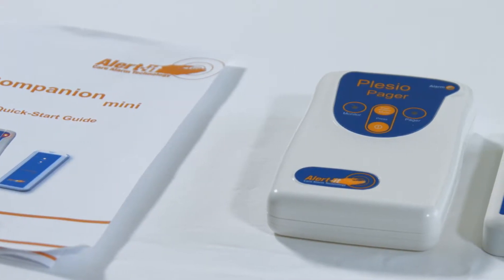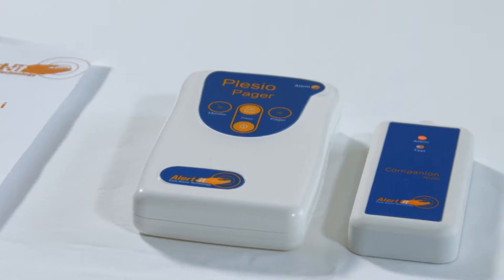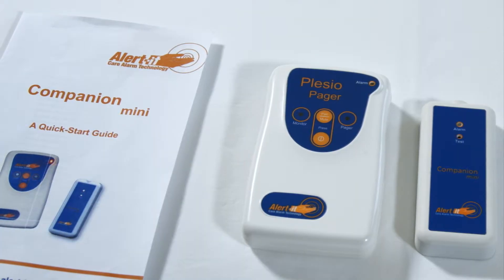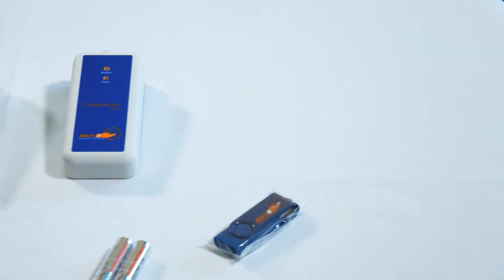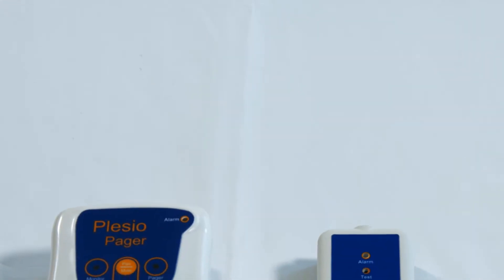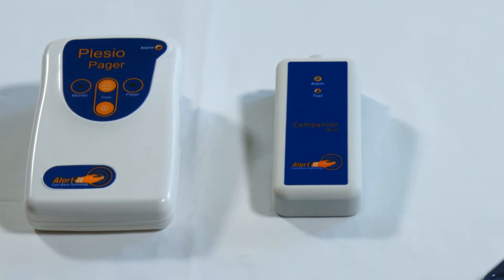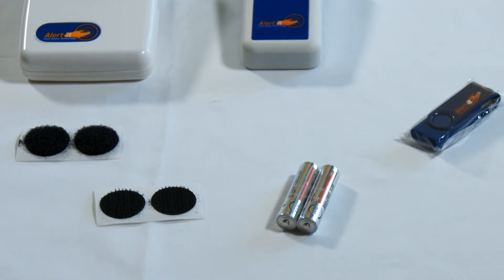This video aims to provide you with an introduction to the Companion Mini and guide you through its easy setup and use. Your new product consists of two main components: the Companion Monitor, which is fitted under the mattress, and the Plessio Pager. You will also find a Pager power supply, cable ties and Velcro pads for securing the monitor, a USB stick and USB cable for additional programming, and a quick start guide with additional information about your new product and its use.